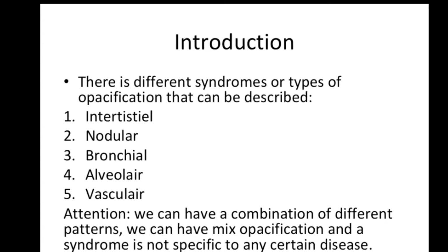Also, we should know, like in complex cases, we can have multiple pattern opacity that we're gonna be a little bit mixed up with them. But this is in very specific diseases, so not in all diseases. And now we're gonna focus more about the basics, not very complex cases.